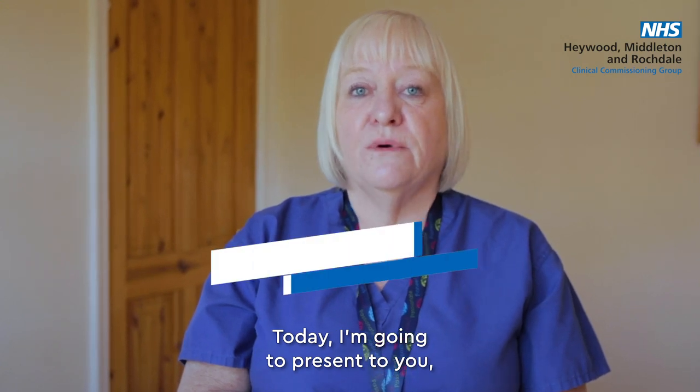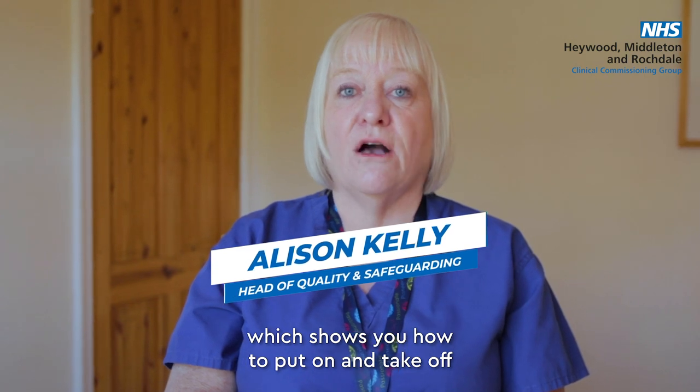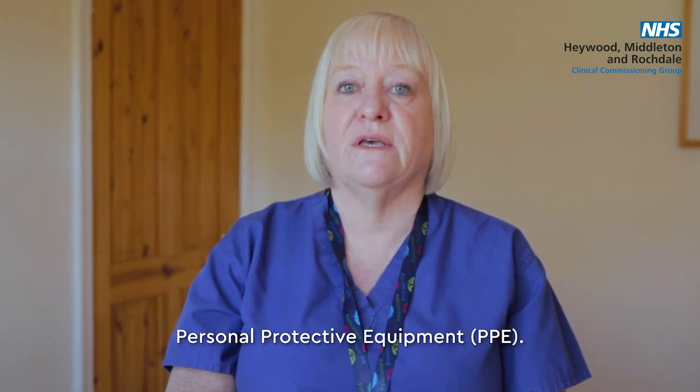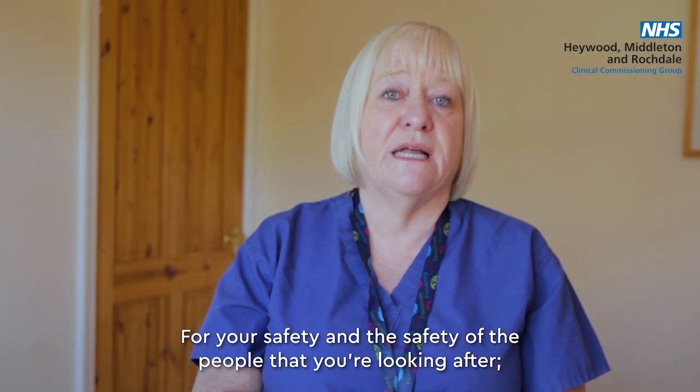Today I'm going to present to you a short video which shows you how to put on and take off personal protective equipment for your safety and the safety of the people that you're looking after.